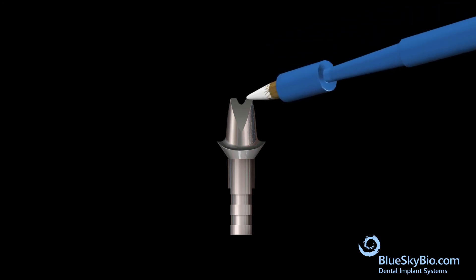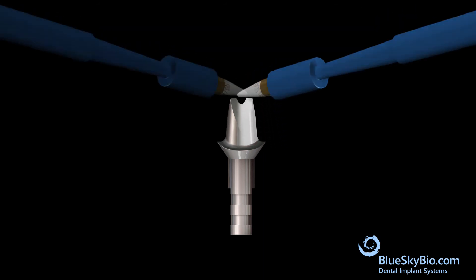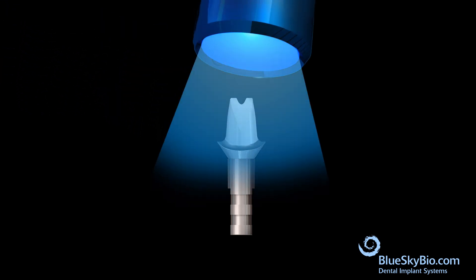Apply a thin layer of white metal opaquer to the abutment. Apply white metal opaquer only on areas that will be covered by the crown. Light cure the white metal opaquer.